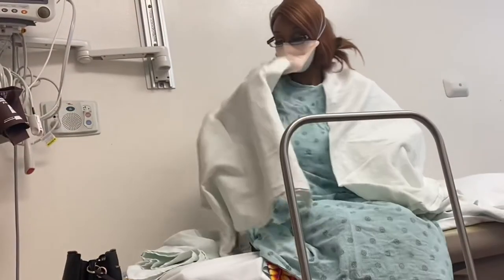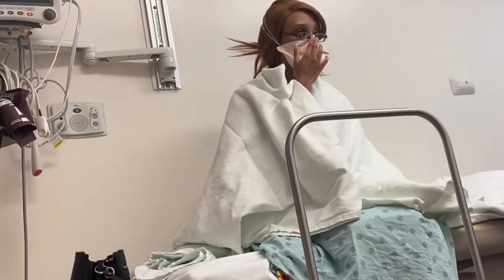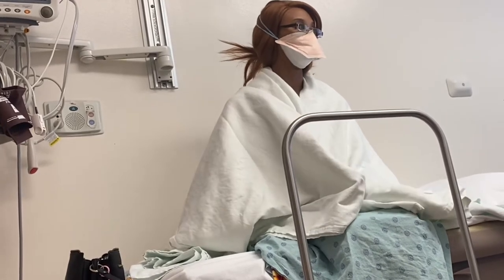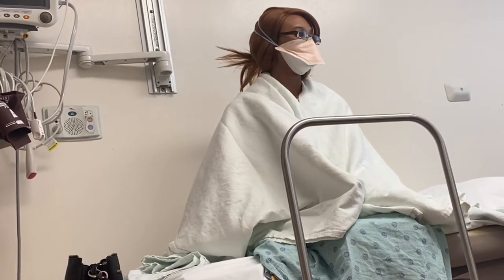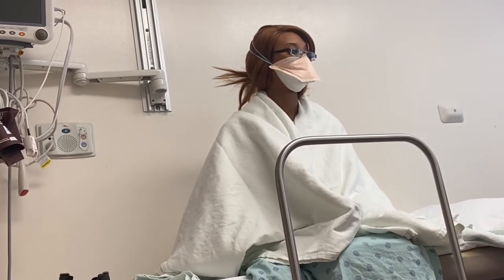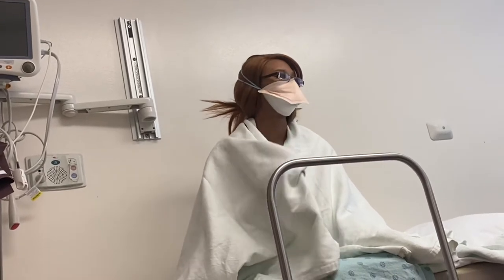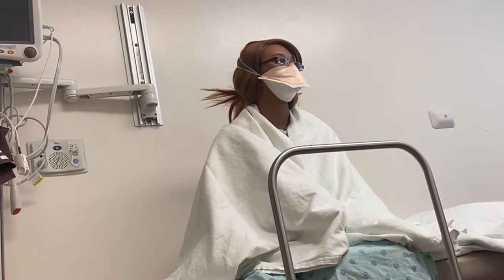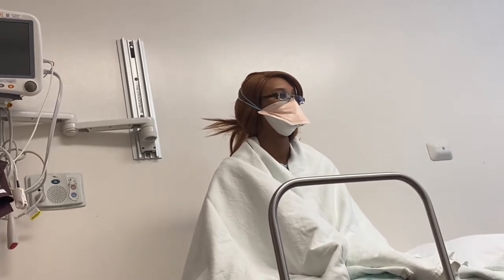All right, so when I get that number where I'm gonna put the overnight one, I'm gonna put the tube in, tape it down, go in there. And what is that number? From the first test. The first test tells me. This is our pressure test, the esophageal manometry. That's the one that tells us what number your esophagus is squeezing at. And also tells me a place called the lower esophageal sphincter. That tells me where I need to put the overnight one. So the overnight one goes a little past? It goes 5 centimeters above the lower esophageal sphincter.